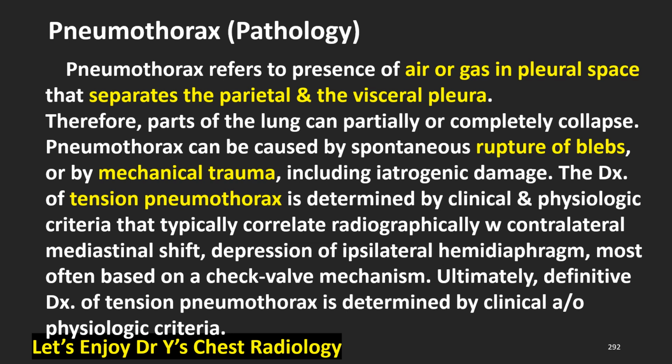The diagnosis of tension pneumothorax is determined by clinical and physiologic criteria that typically correlate radiographically with contralateral mediastinal shift, depression of ipsilateral hemidiaphragm, most often based on a check valve mechanism. Ultimately, definitive diagnosis of tension pneumothorax is determined by clinical and/or physiologic criteria.